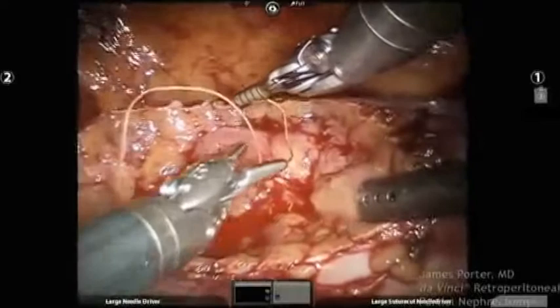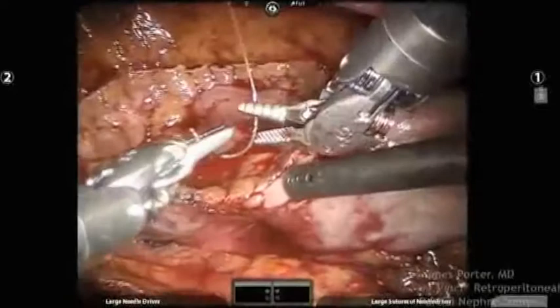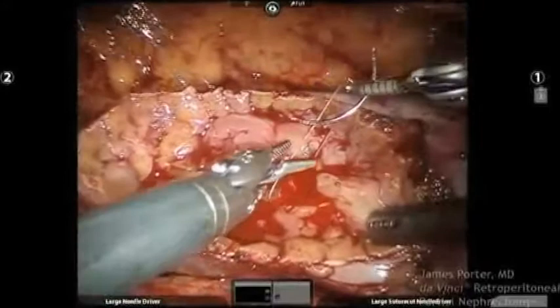Do you worry about pseudoaneurysms? Every time I see someone running their base sutures, it's kind of an indiscriminate throw running down the base, rather than where Jim is actually identifying the actual lumen. Pseudoaneurysms are a concern with needles running through deep vessels. Has that been a concern for you all? And the other question is, when you didn't run the base, did you have more hemorrhage?